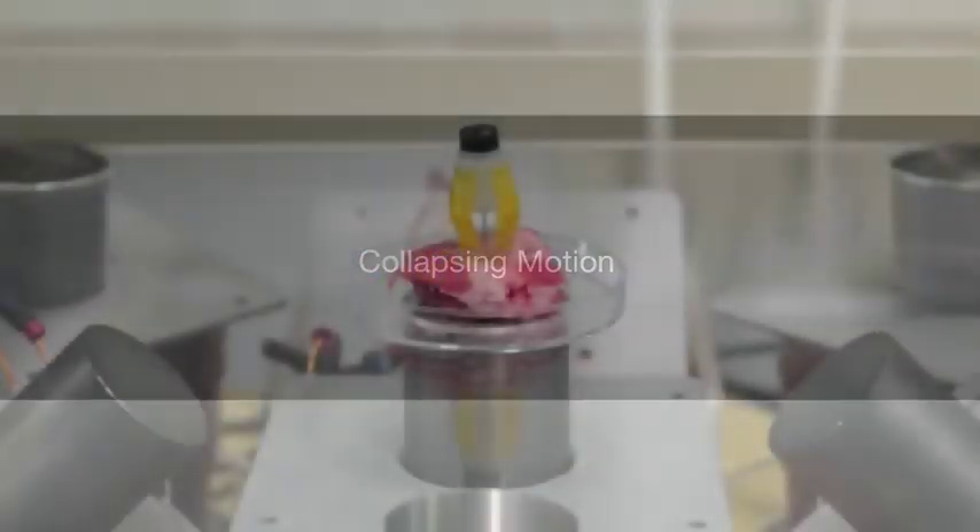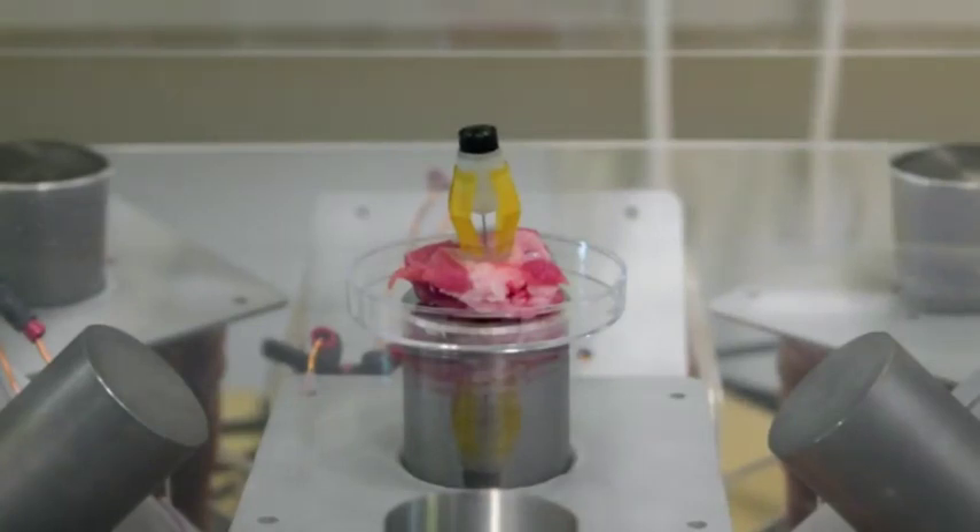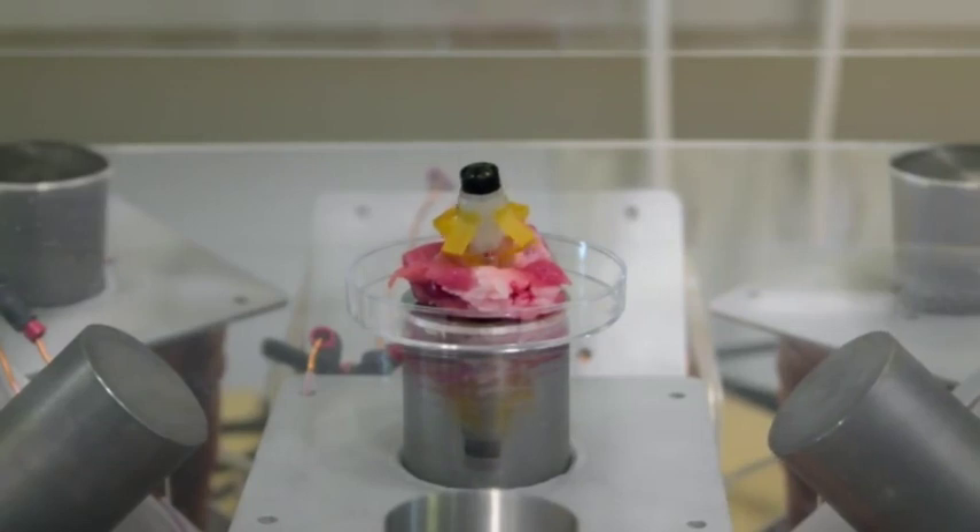The robot is driven by externally generated magnetic fields. Strong magnetic field gradients cause the robot to collapse and insert the needle into the tissue, while the magnetic torque stabilizes the robot's orientation.